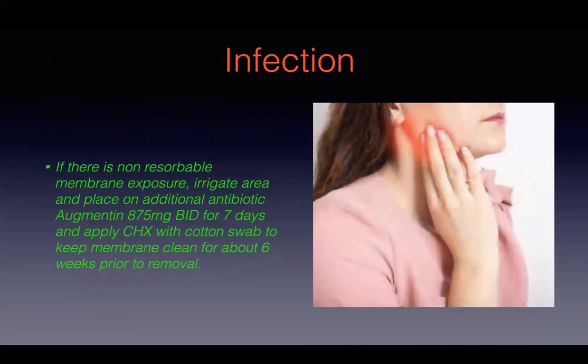And here you can see the pre-op defect at site 8, and about 3.5 months later after the GBR, with the implants in place. And you can see it's also a very predictable procedure, with the bone having filled in.